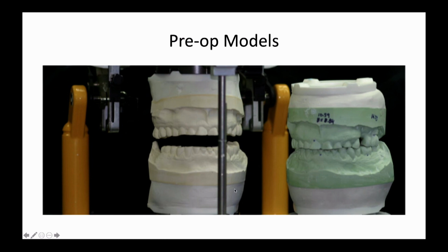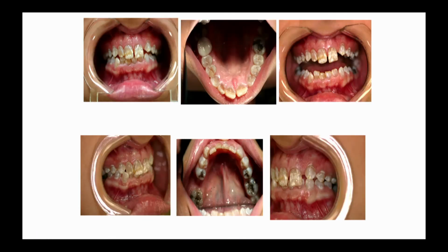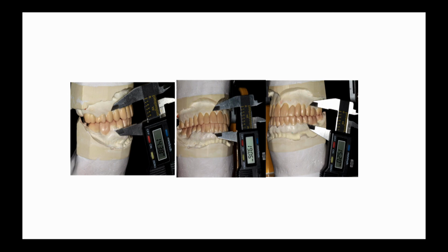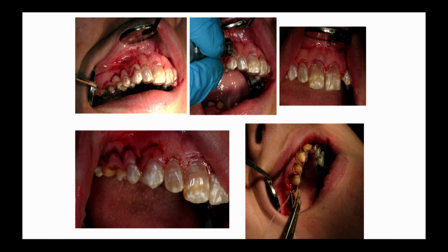Bite transfers and articulators. I'm getting to a point here shortly, but there's a lot of work here. This is wax-ups, measuring posteriorly your wax-up to make sure that it's the same in the mouth. So this measurement here, the whole nine yards. So we went from that on an articulator, measuring again to modify and verify the bite through the whole process that we just showed you the first time. And we're going to do some gingival recontouring and all that, so this case even gets more complicated. But again, at the end of the day, jaw-to-jaw relationships, how well you do with that is going to dictate how well you do with the case.